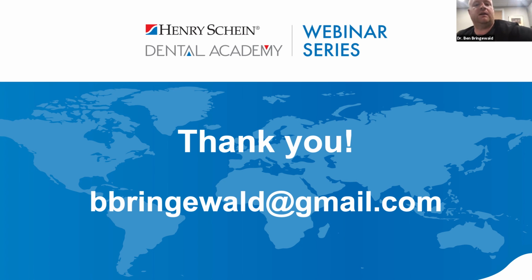I will follow up. If you send me an email, I will follow up with you and try to get the answer to that. As far as I know, because we have the Primescan at the office, and we also have an Omnicam at the office, those are the only systems that we really use for that, especially with the CEREC suite.